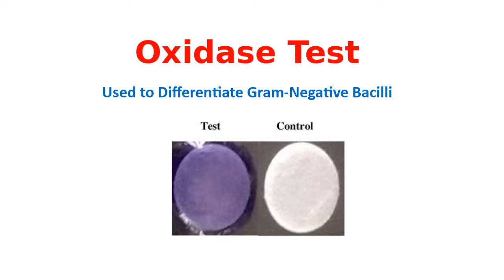If they're oxidase positive, they're going to be things like Pseudomonas, which is clinically relevant. And those things are aerobic.